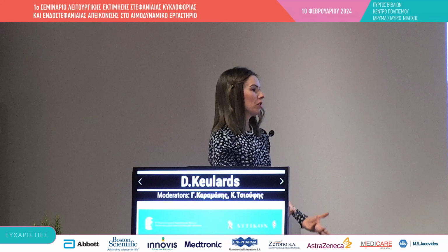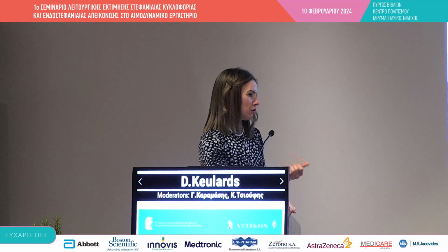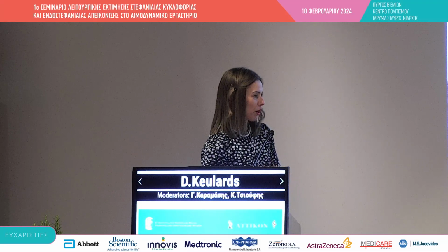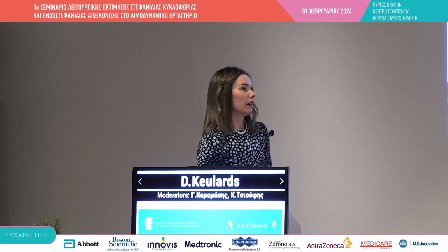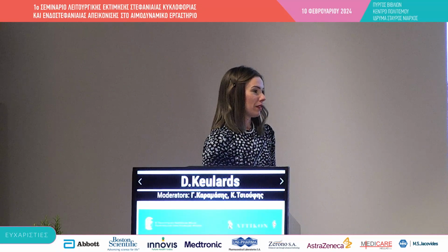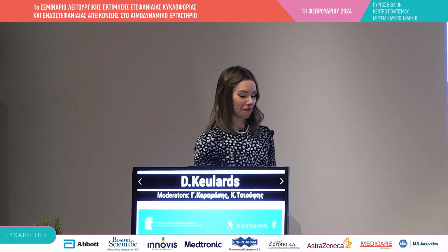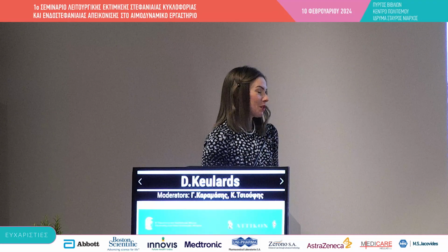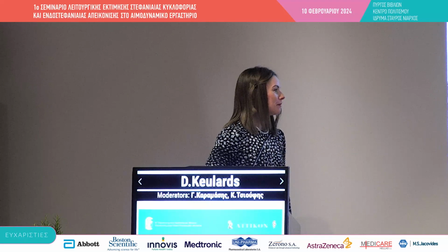But how practical is it to do in the cath lab? Yeah, well, it is true that you, of course, need to invest in your cath lab, but you already need the Abbott pressure wire and the software to measure the microcirculation anyway. But you do need the RayFlow. So that's a little bit more expensive, of course. But I think it's worth it because, in our humble opinion, I think MRR is the future. But we will see that in 10 years. I think EUROCRAFT, this large registry, will give us the answer for this.